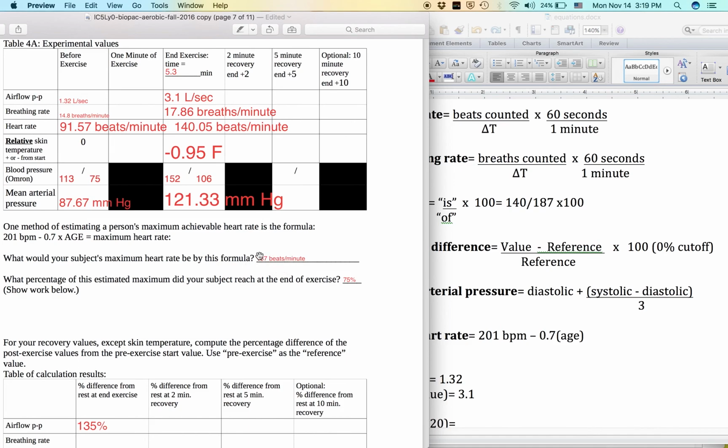If it is less than 100%, as in this case, then it is only a portion of what can be reached at the maximum. So here we have a cutoff of 100% for greater than or less than a reference value, but down here in percent difference, our cutoff for larger or smaller regarding the reference value is going to be 0%.